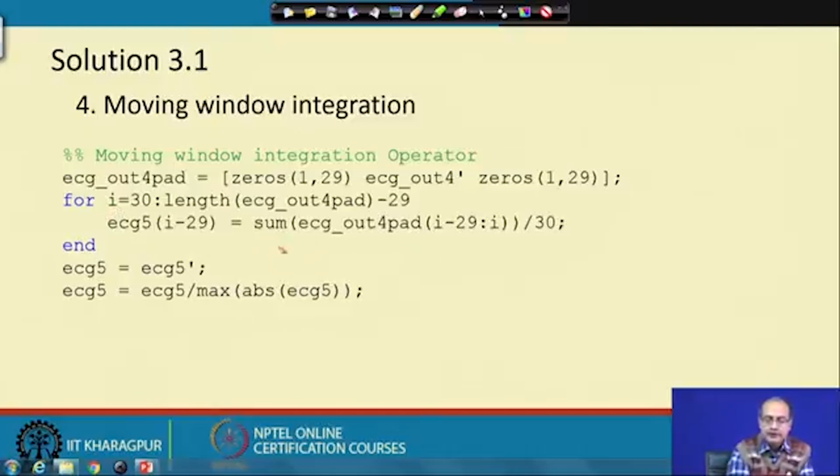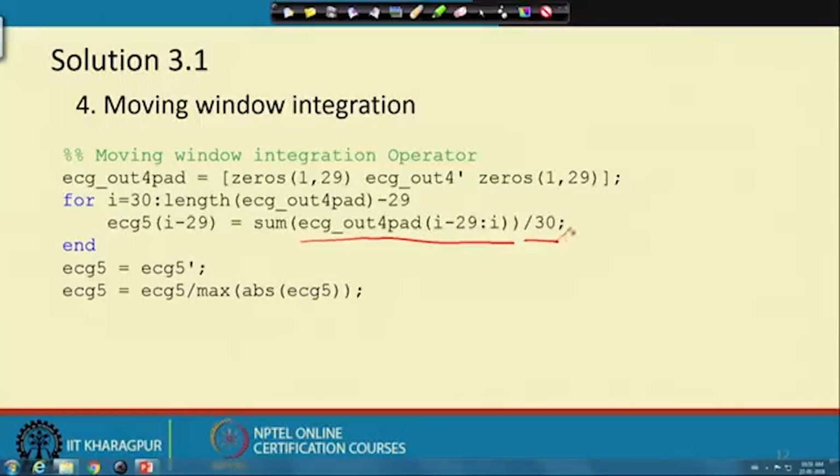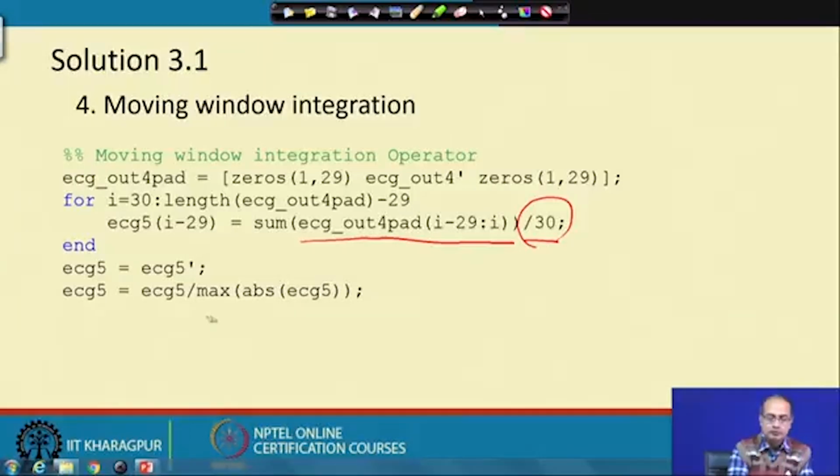Okay. So, we should take the last 30 points of the signal and do the averaging. So, it is divided by 30. Okay. In fact, for real time implementation you may avoid this, because later on the scaling is done, it is not an offline operation. So, here we are doing the scaling. So, we could avoid this one, but we try to keep the form proposed by Pan-Tomkin.